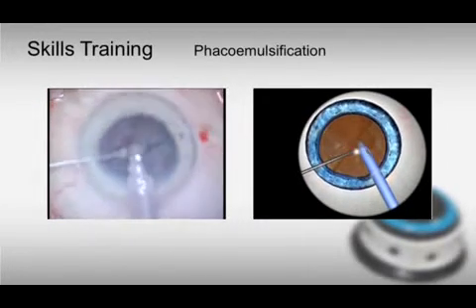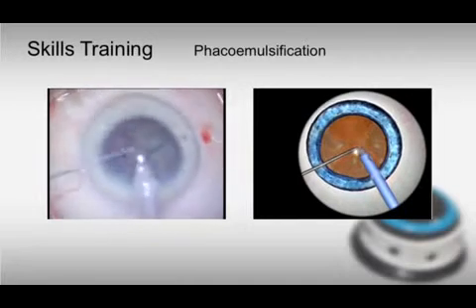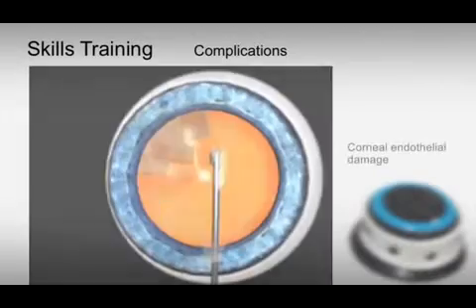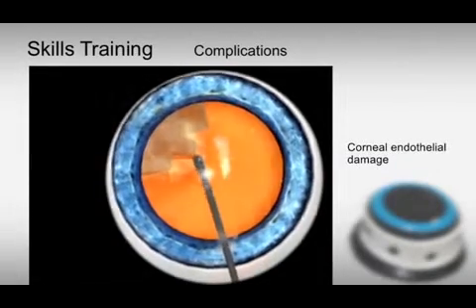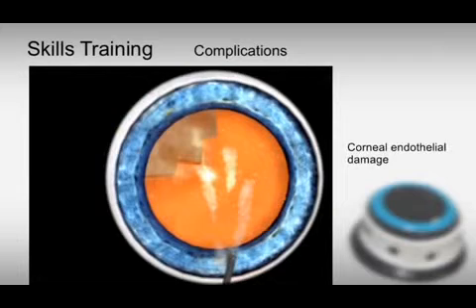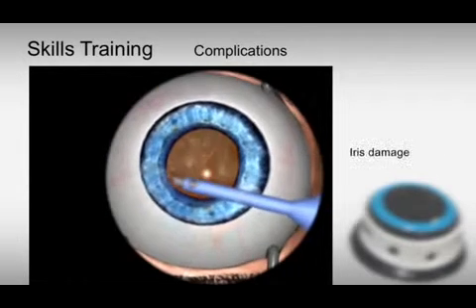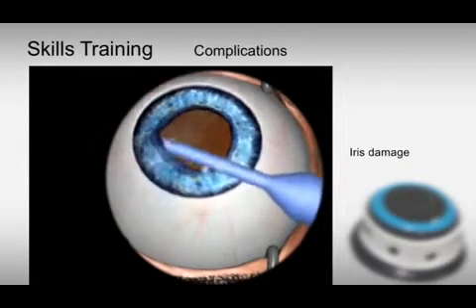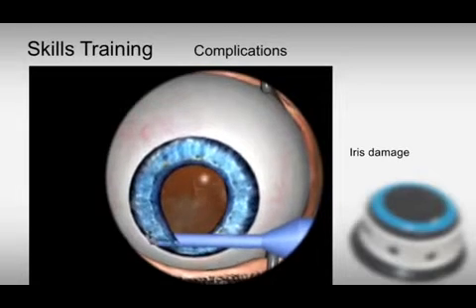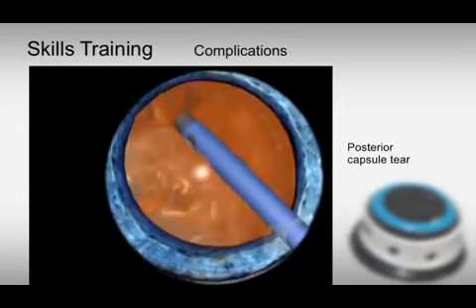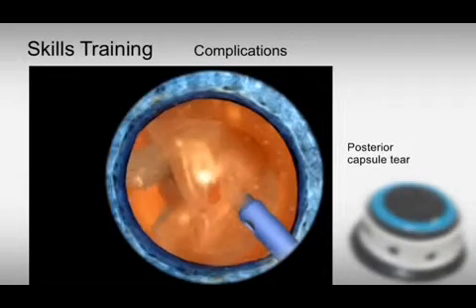The user can also be confronted with complications according to their performance. This is an example of corneal endothelial damage with consecutive edema. Here we can see manipulation of the iris with the phaco tip, and posterior capsule rupture during phacoemulsification.